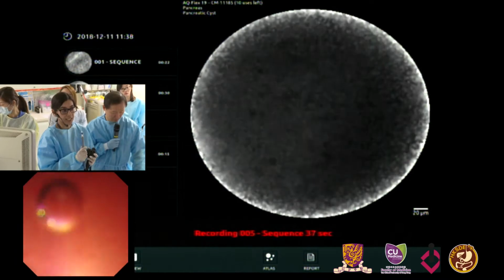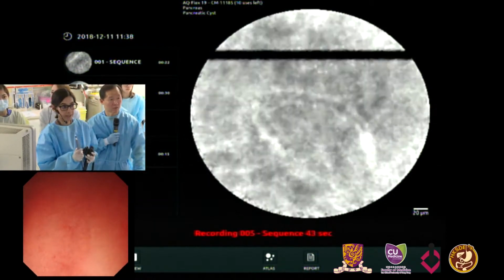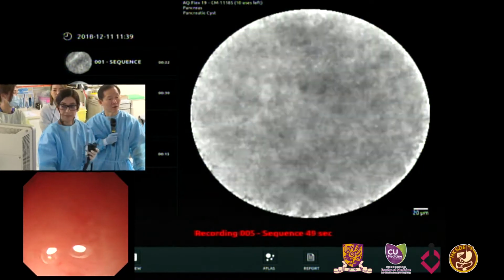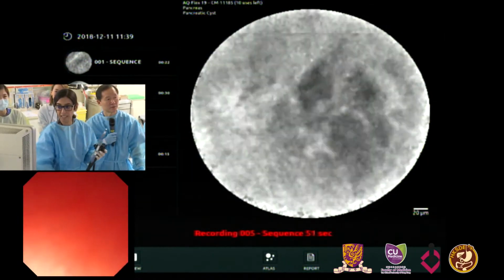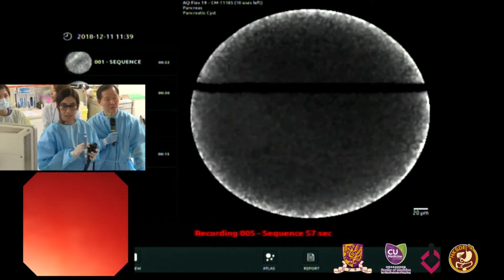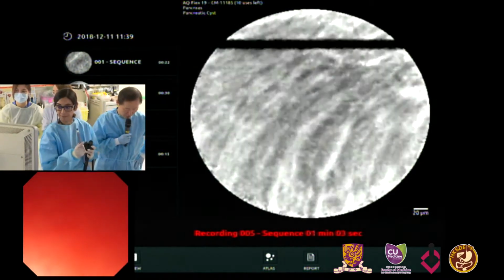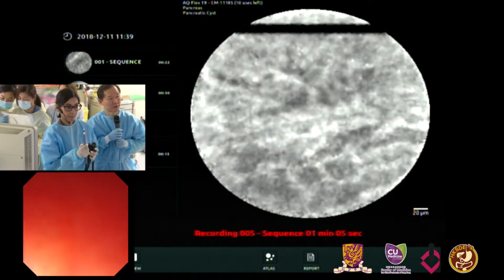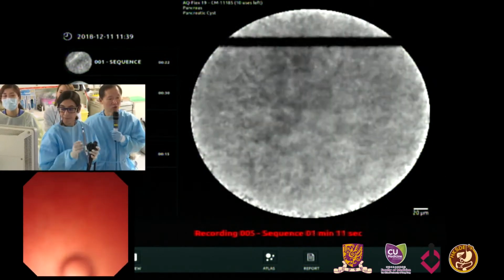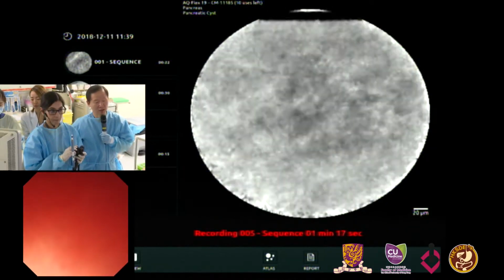In this case, it's a matter of trying to find any actual intestinal epithelium. But we'll try just for a few more seconds, and then if we cannot find anything, we have one more tool to try to get a histologic diagnosis. We were discussing using microforceps. If this does not give enough evidence, then we can add one more. We are going to use Moray forceps to do the cyst wall biopsy, and we want to check the lining epithelium.